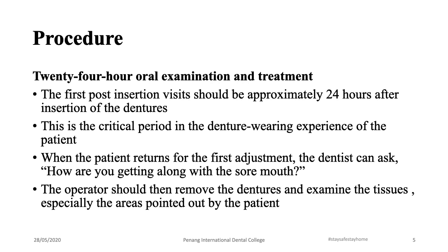So it's always good that you tell the patient to wear it 24 hours prior before he comes to this checkup. Sometimes it might be very painful to the patient. In certain instances, you let him leave the dentures out, but before coming to the appointment, ask him to wear it for at least 12 hours and then come, so that it is easier for you to evaluate.